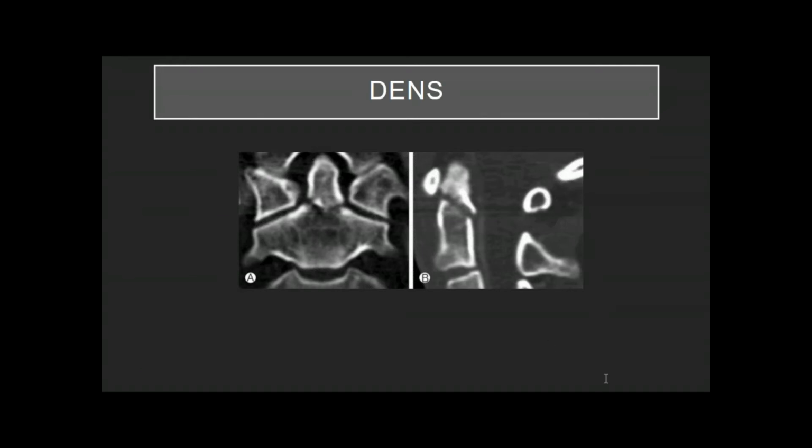Sure, so a scenario in which I would order a CT scan with contrast is if the patient is getting a full body scan, if they're essentially getting pan scanned and you're looking at chest and abdomen and pelvis, and you're already giving the patient contrast for those areas, and you want to scan the spine at the same time, then often we will have contrast on board when we read those. But again, if you're only doing the spine, specifically only the spine, and you're looking for fractures, contrast is not necessarily necessary to make fractures show up any better.